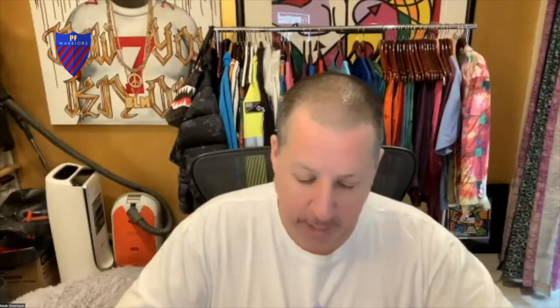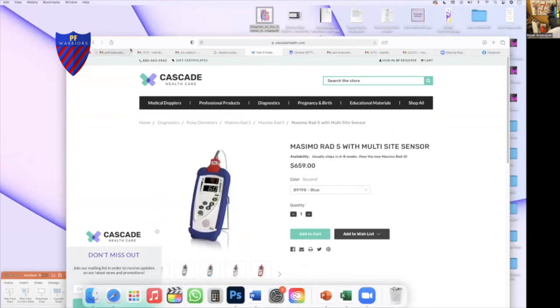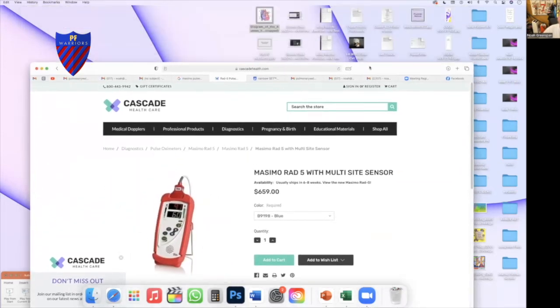We use Masimo in our clinic — the clinical, medical-grade ones, which are the absolute top. Roy Smith is demonstrating the Nonin; we use that in our study and found it very accurate. The one we use in our clinic is the RAD-5, which is the most accurate one available and is specifically made for people who have trouble getting a reading or who have poor circulation.